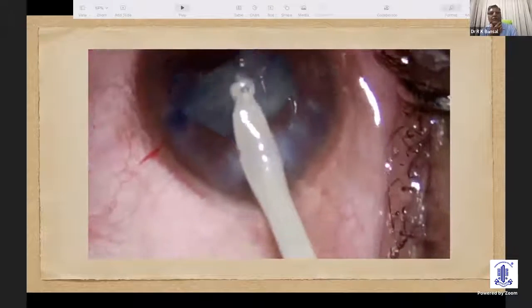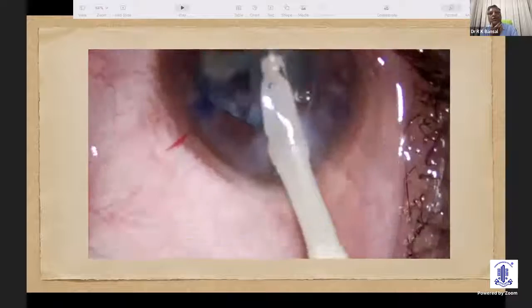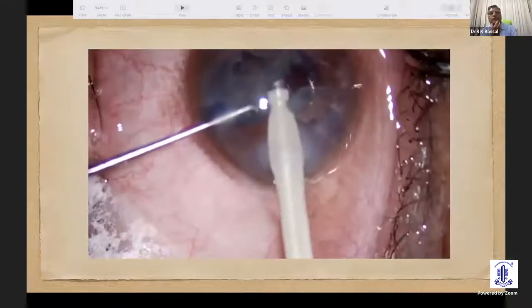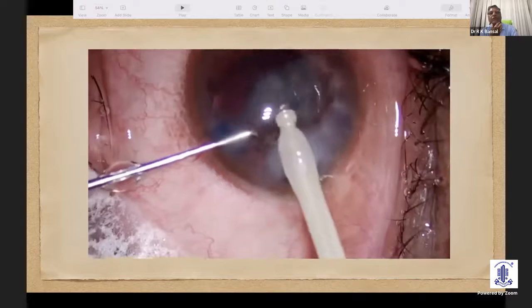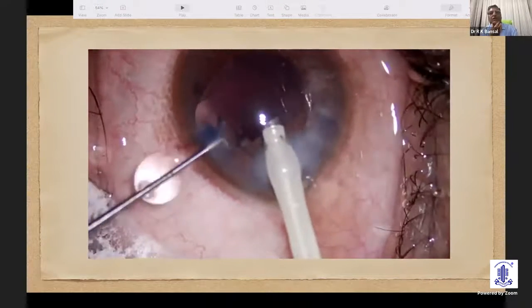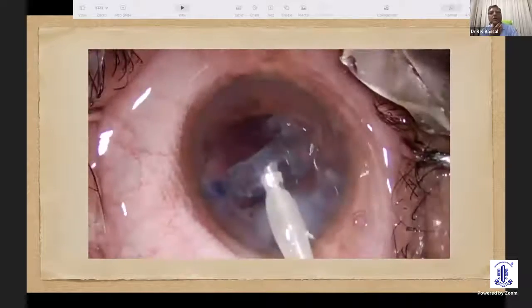Using low parameters here because I already know that there is extension of the capsule into the periphery. We have to be very careful and manipulative to bring the nucleus into the anterior chamber, do the chopping, and perform the phacoemulsification. This patient's lens was not very hard — just grade 2 — so it was possible to bring the nucleus out and then do the phacoemulsification. Using very slow parameters and carrying on carefully.